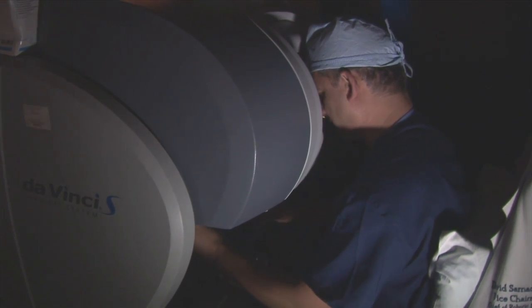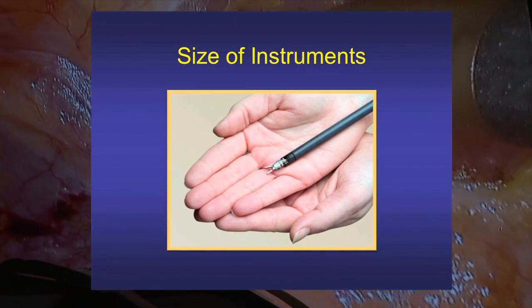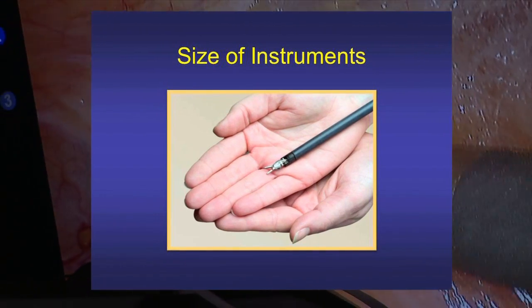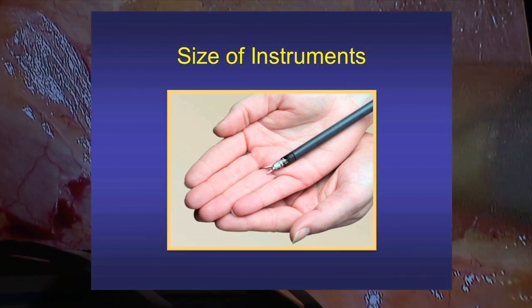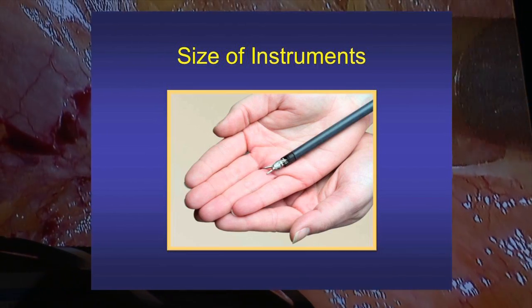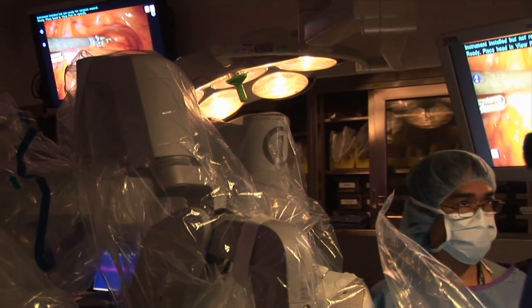The first thing I'm going to do is take the bladder down. These instruments are about 8 to 10 millimeters — they're very small — and that's one of the reasons why when the surgery is over, patients wake up with six small tiny holes in the abdomen that look like mosquito bites.